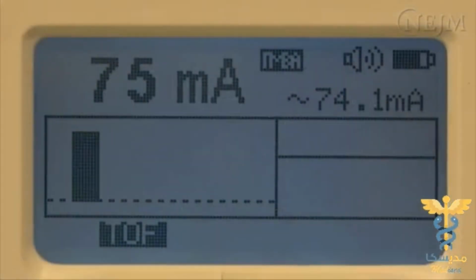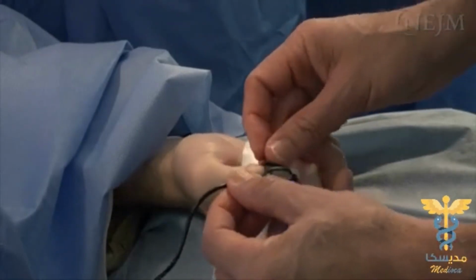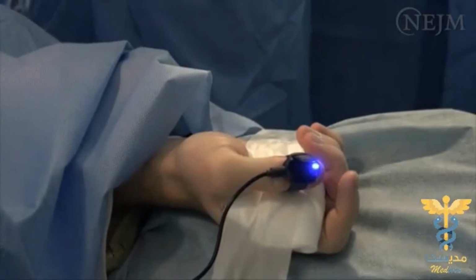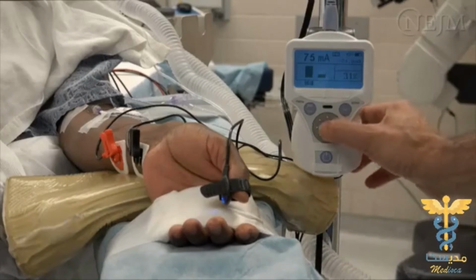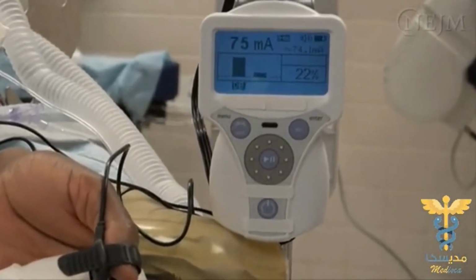In the clinical setting, the tool used most frequently for the objective evaluation of neuromuscular function is acceleromyography. To perform acceleromyography, affix the accelerometer onto a moving digit, ideally the thumb, to measure acceleration in response to ulnar nerve stimulation. It is not difficult to set up an acceleromyography device. The thumb must be allowed to move freely, and there can be no movement of the hand or the arm, since any such movement may change the direction of thumb adduction or the baseline measurement, necessitating recalibration.